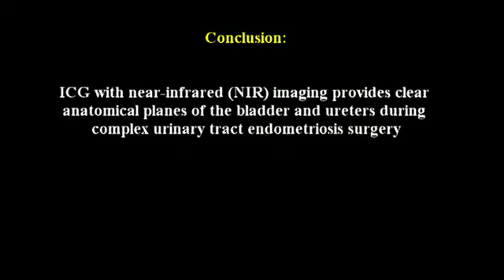As conclusion, ICG with near-infrared imaging provides clear anatomical planes of the bladder and ureters during complex urinary tract endometriosis surgery.